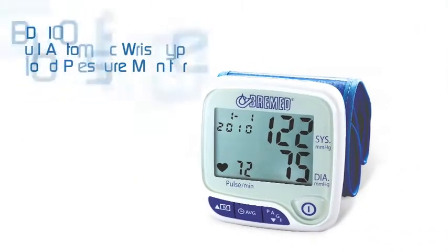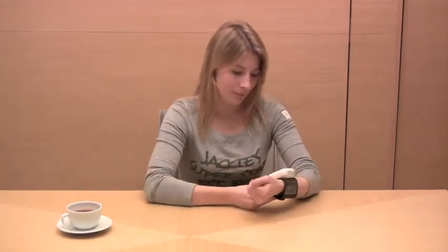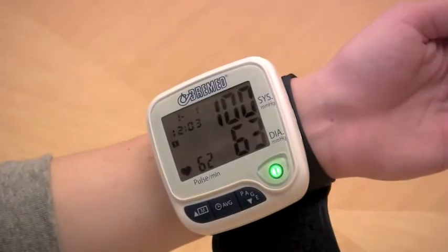The BD-8100 blood pressure check can be effectively made by using the Bremit BD-8100 wrist type blood pressure monitor, easily attached on your wrist. One touch operation with an extra-large LCD display, easy to read, with two-person use and 50 memories each.